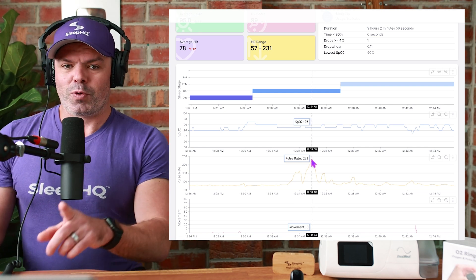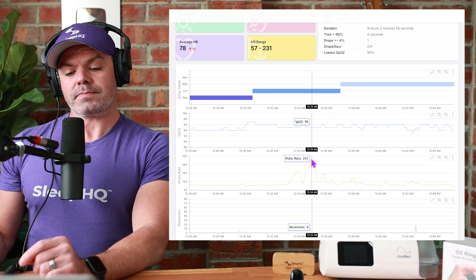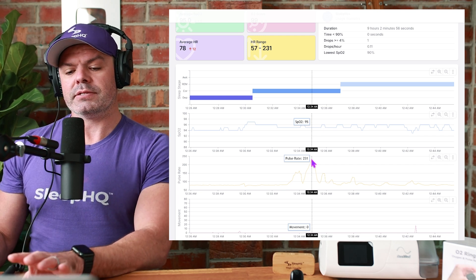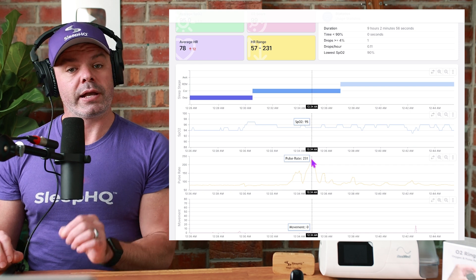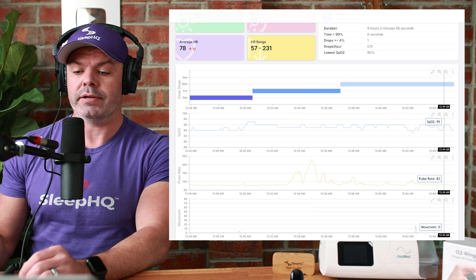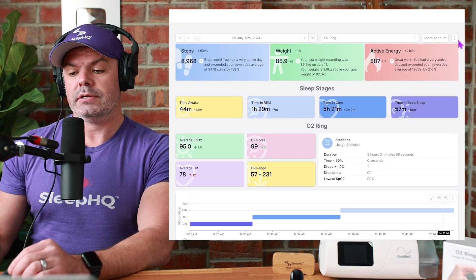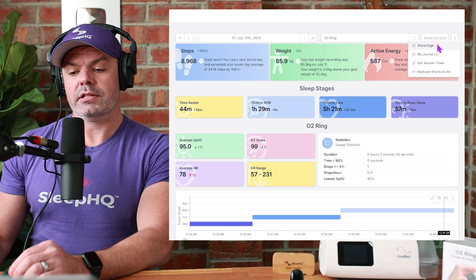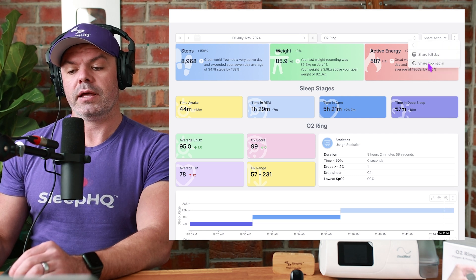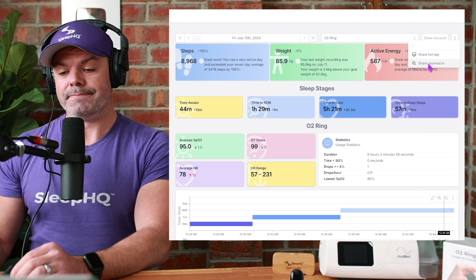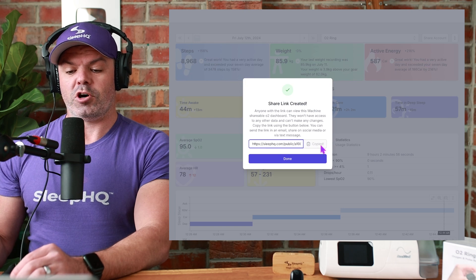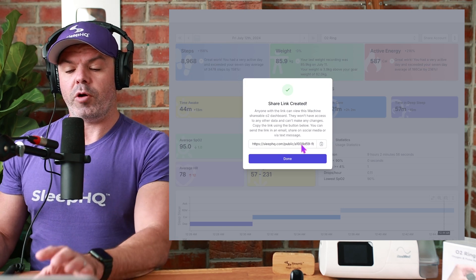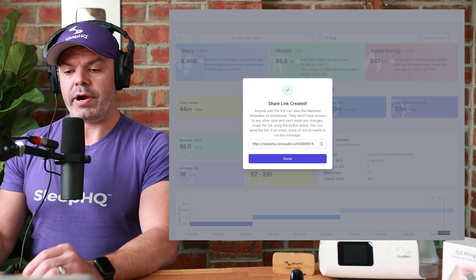And this happens quite a bit. I'll tell you why in a moment. And I'm concerned about this and I want to send this information to a cardiologist. I can come up here again after I've zoomed in, click the three dots, click share page. And now I can share zoomed in. Copy. Now I've copied that link. I'll show you what it looks like in a browser.